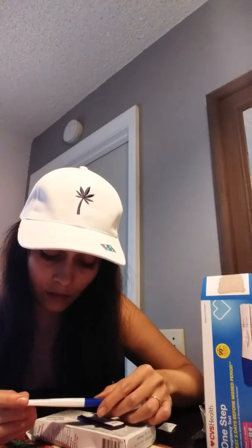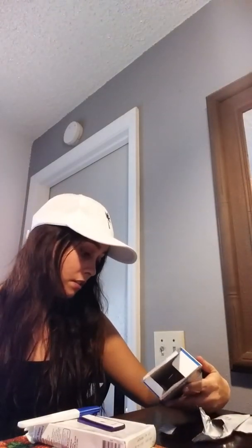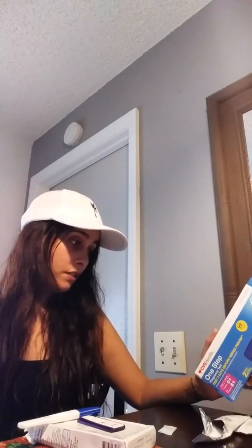Oh my goodness. You guys — there's a line. There's a line, oh my gosh. There's a line for me, and I've never taken these before, never. I see a line. What's concerning to me is that from the last video — you guys can go check out my progression lines — on certain tests it shows really good and then on others it doesn't.